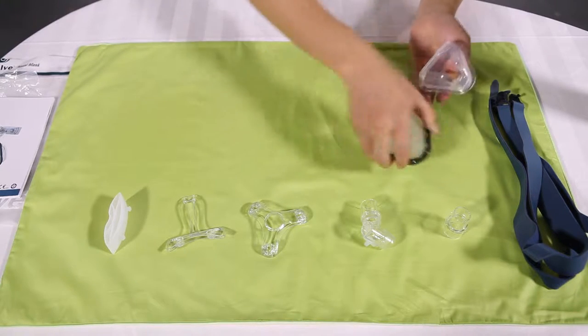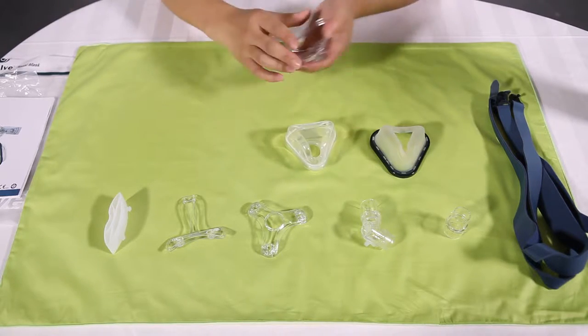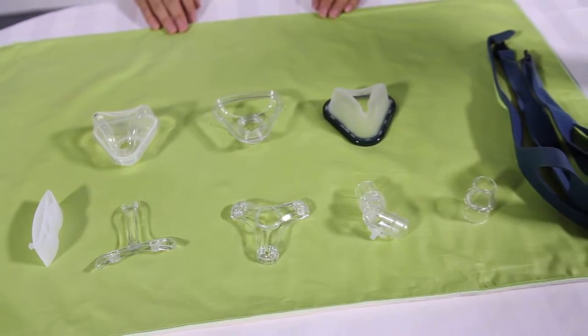Detach the thin pad, cushion, and cushion frame. Peel the cushion away from the cushion frame. The NM1 can be disassembled into 9 parts in total.